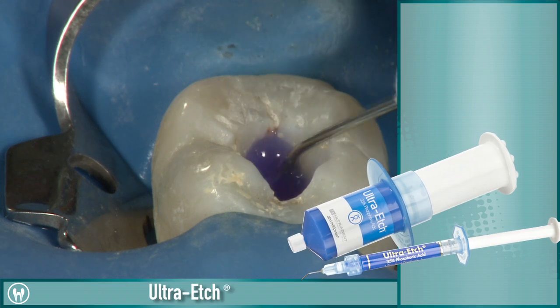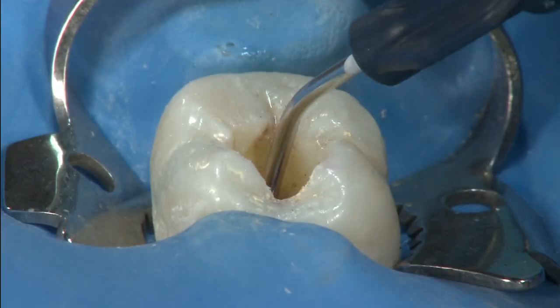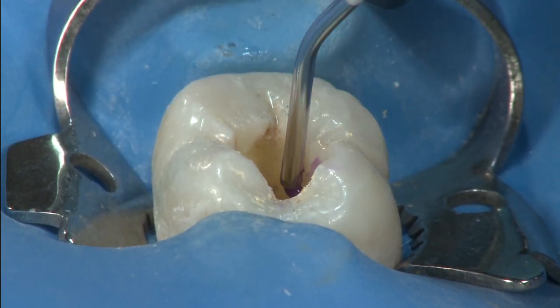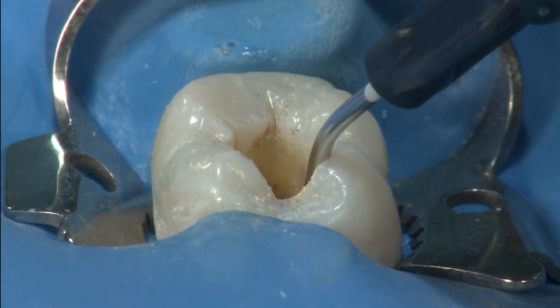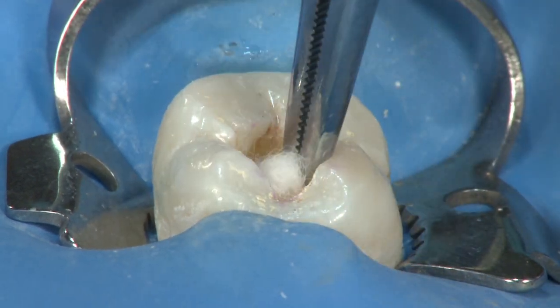Etch the entire tooth structure inside the pulp chamber. Permaflow purple can then be placed over each orifice of the entire pulp floor. Be sure to clean excess Permaflow purple from the chamber prior to light curing.